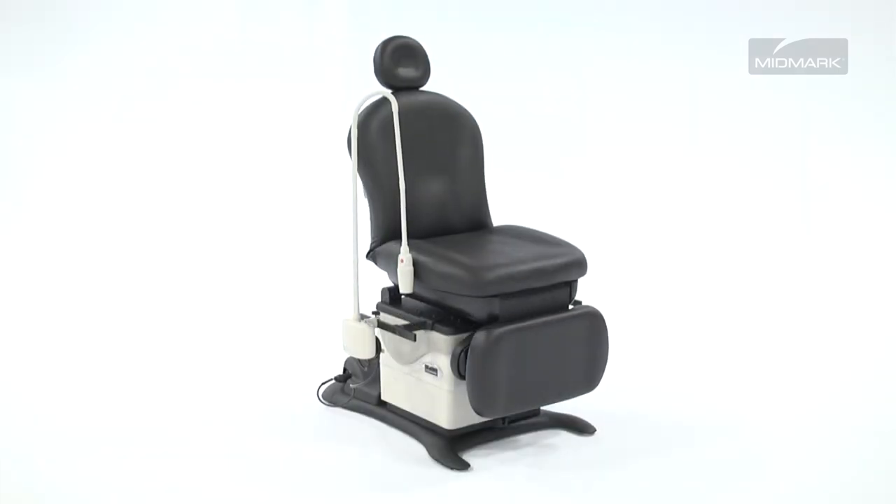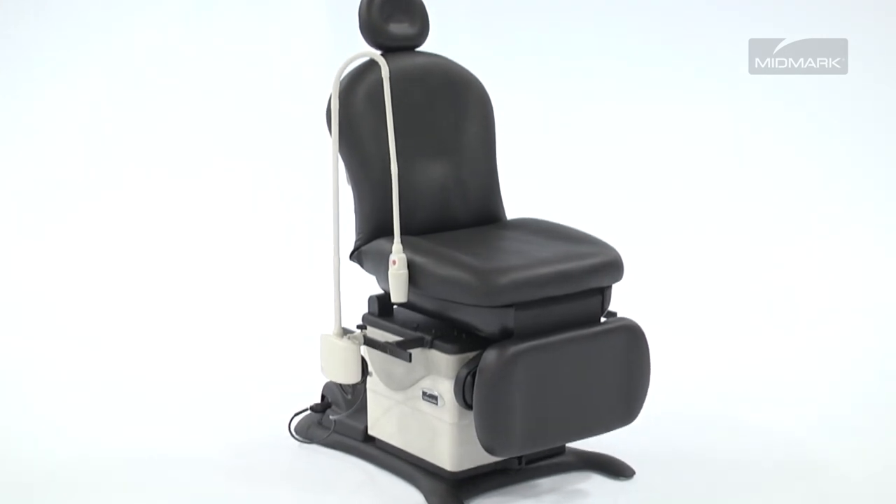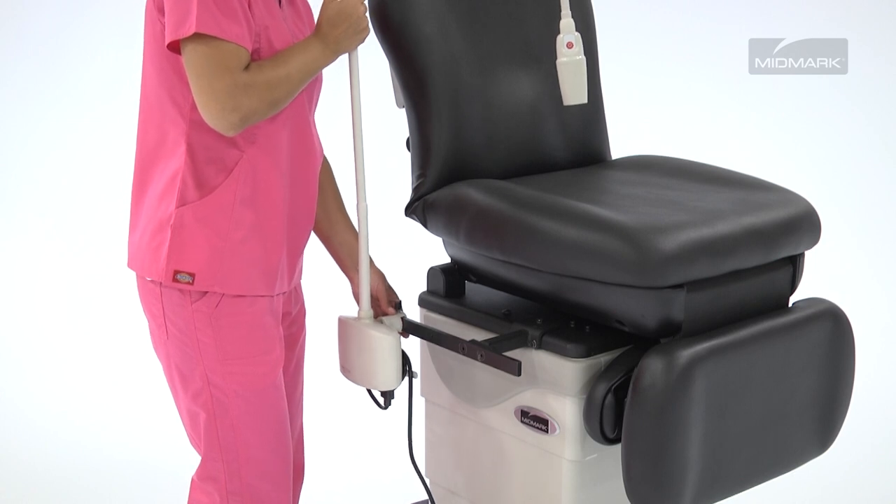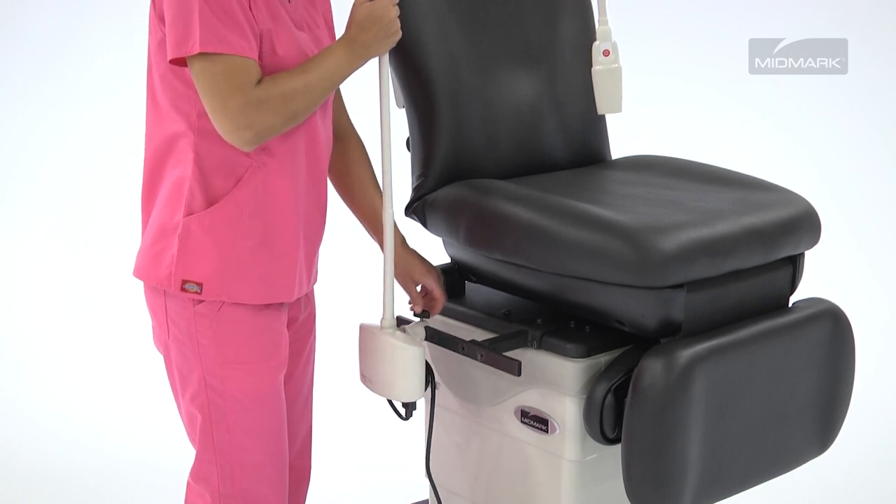The Ritter 253 LED Exam Light is a space-saving solution for your exam and procedure rooms. Mount the light to the left or right side of your Midmark 641 table for convenience.